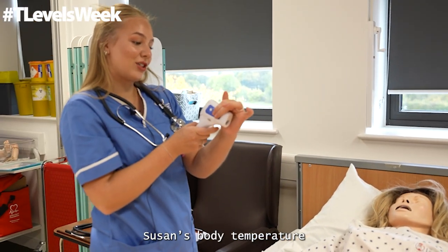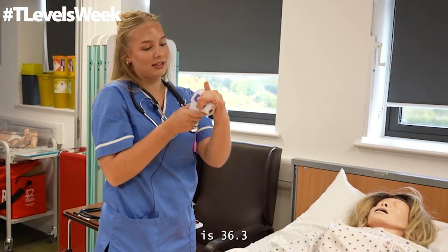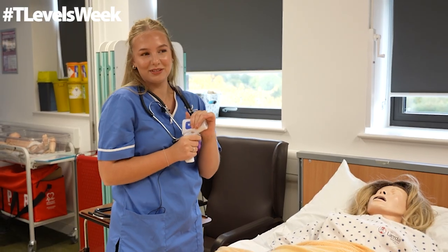Okay, Susan's body temperature is 36.3, which is not too bad.